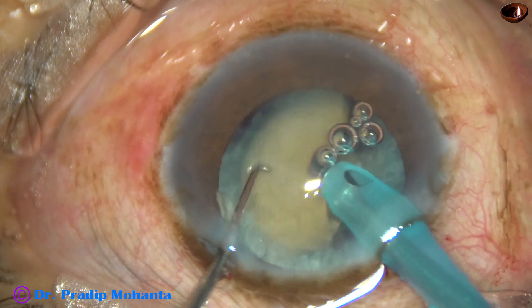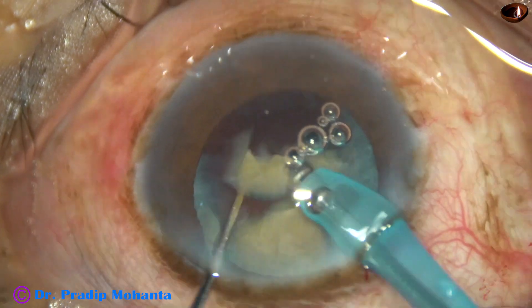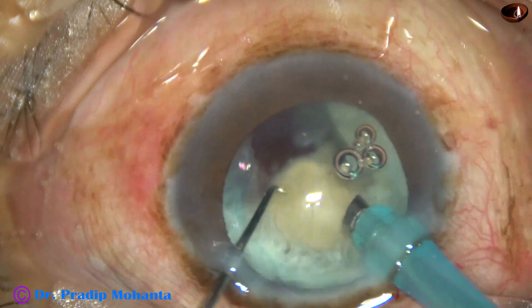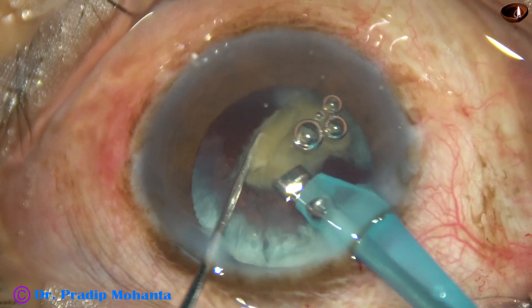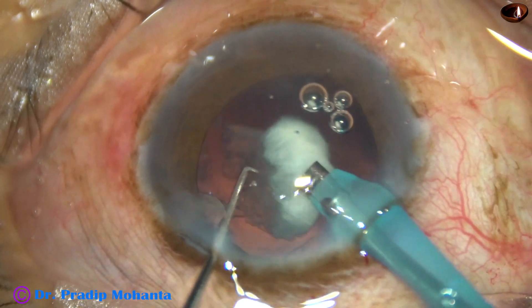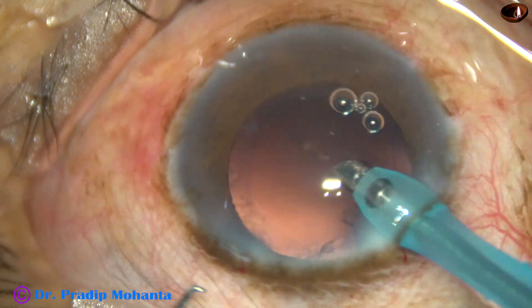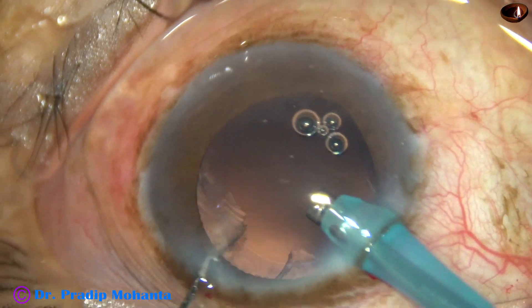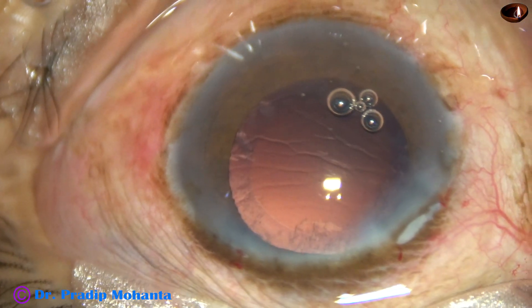The phaco energy used in this case was about 75% ultrasonic energy. The flow rate was 45 ml per minute and vacuum was 450 mmHg. The nucleus is now down to the last nuclear base, and all around there is some material — this is the degenerated epinucleus and cortex. Most of it has been removed, and very little cortical matter is remaining.